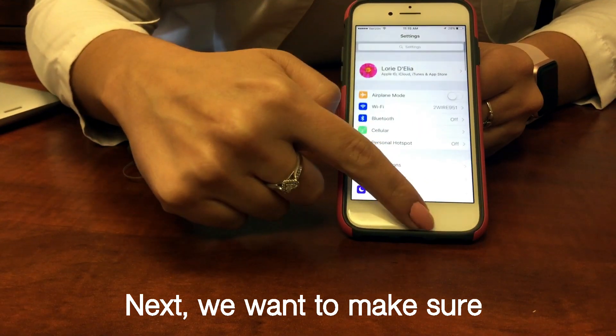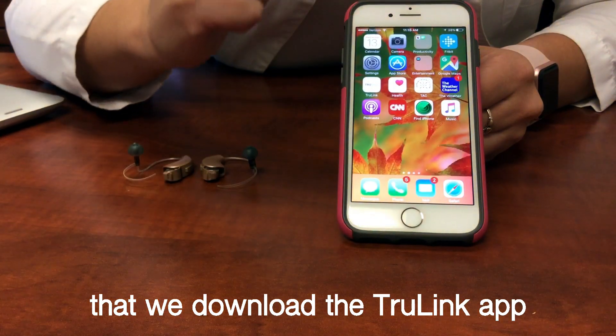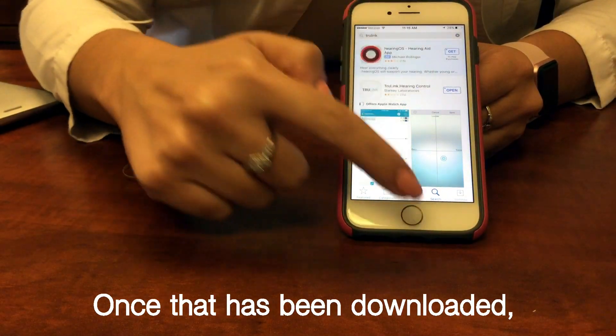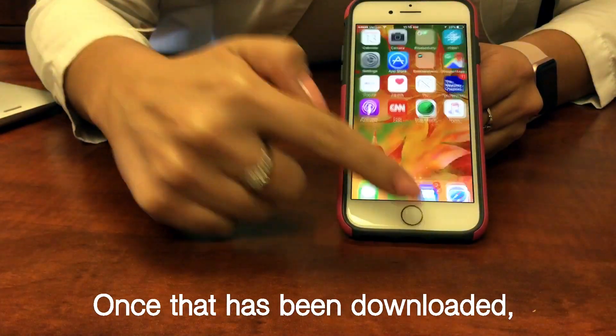Next we want to make sure that we download the Truelink app in the App Store. Once that has been downloaded, we are ready to go.